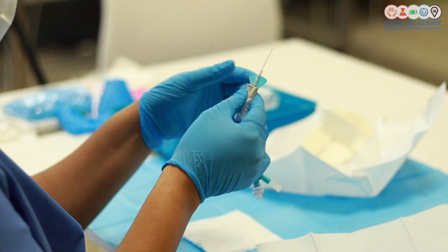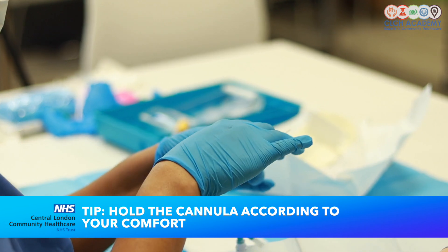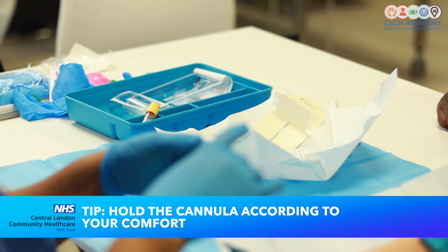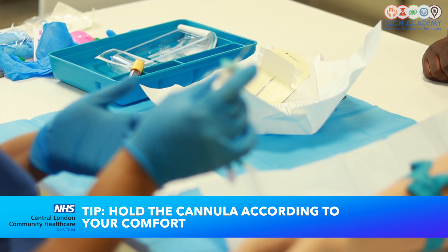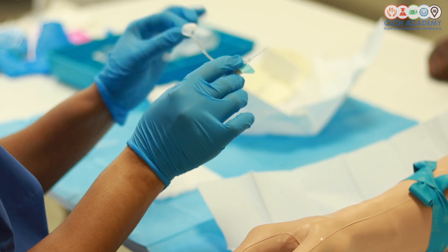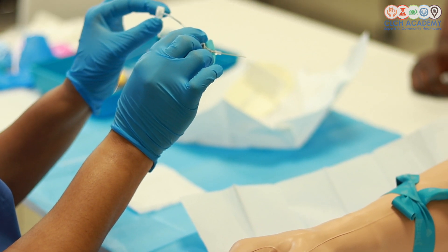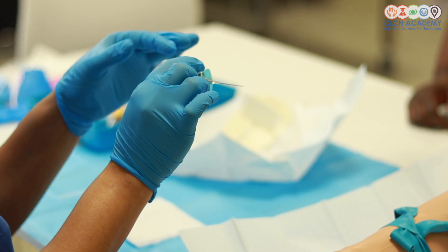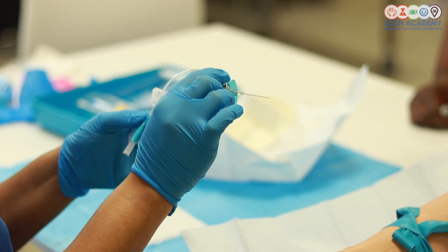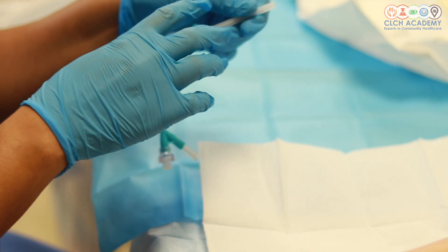Next I'm going to grab my cannula and unsheathe it. You can choose to hold your cannula like a pen if that is more comfortable to you, or you can hold it against the wings if that gives you better grip — you will choose what's most comfortable for you. It's got its own needle free device — make sure you keep the clamp open so that you can see your secondary flashback once it's in the vein.